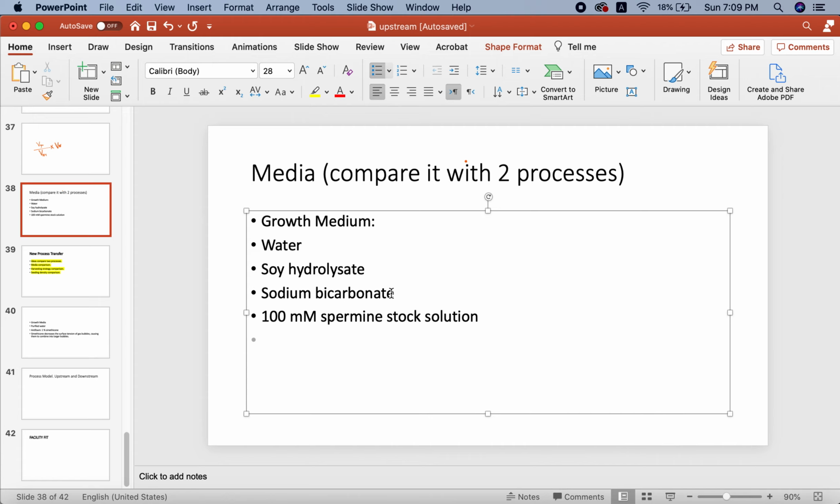Wolfie, ABM 44, L-glutamine, L-tyrosine, sodium bicarbonate, dextrose anhydrous, spermine tetrahydrochloride. Murphy, ABM 416, L-glutamine, sodium bicarbonate, L-tyrosine disodium dihydrate, spermine tetrahydrochloride, manganese 2 sulfate H2O 1.0 millimolar stock solution.